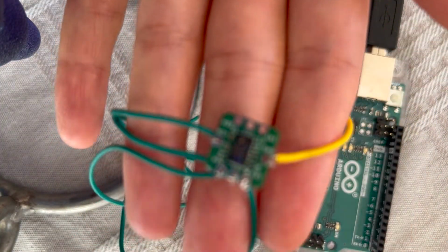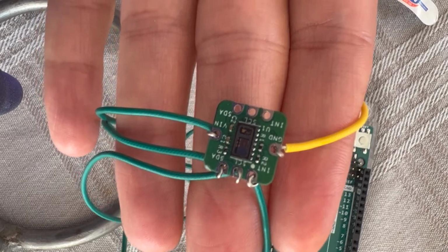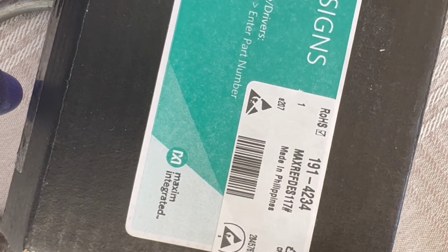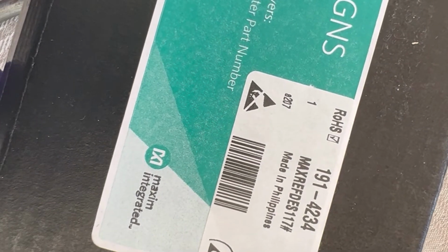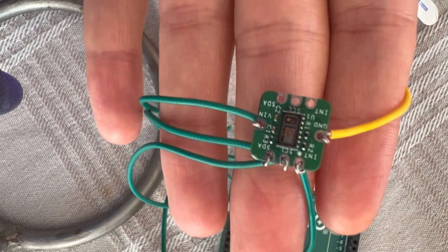So let's see. Let's start by looking at the sensor itself. We are using this model, but the code that I use works for MAX30100 as well, 100 and 102 and 105 maybe. But yeah, this is the one that we have.